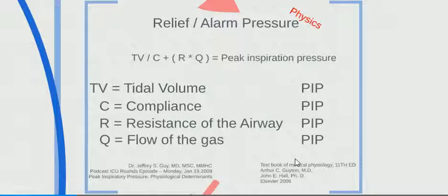this, because what it's measuring is peak inspiration pressure. That's what that alarm pressure is. Whenever you take in a big breath, the amount of oxygen getting pushed into your thorax is getting measured. It's measured by a pressure, and it's called peak inspiration pressure, or PIP.